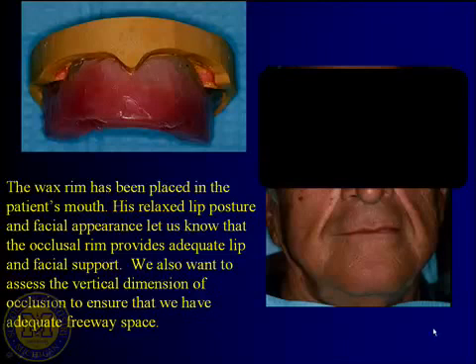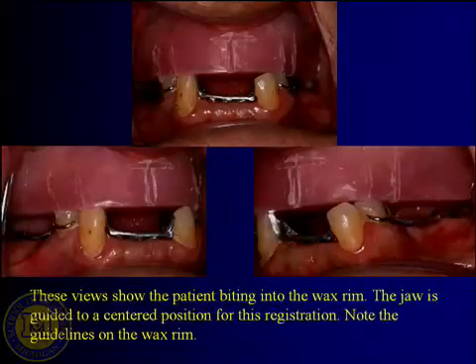And in this situation, because if you're doing a combination case, the presumption is that there are some lower teeth present. So even if you don't have wax occlusal rims, or if you don't have your partial denture framework tried in, because there are some natural lower teeth, then the natural lower teeth themselves will come up and bite into the wax occlusal rim. And so you can get an estimation on occlusal vertical dimension. So the OVD, what should the chin-nose distance be? Okay, you work that with your faculty and you work that out.